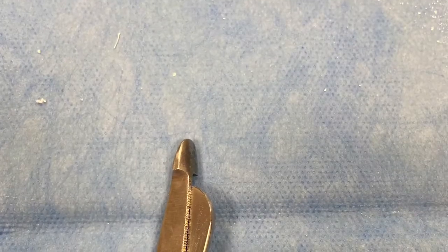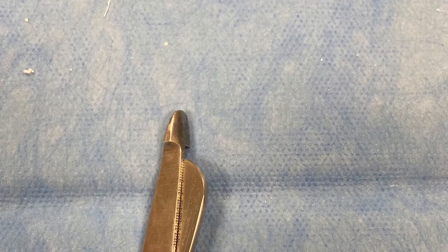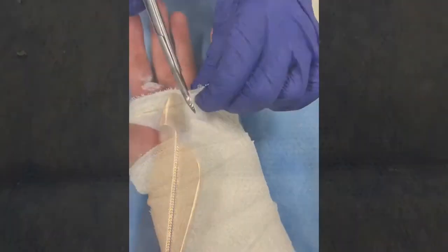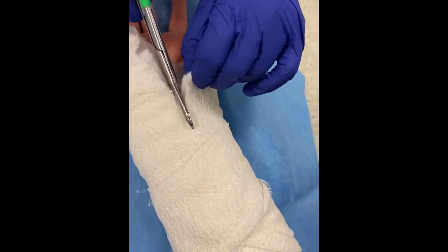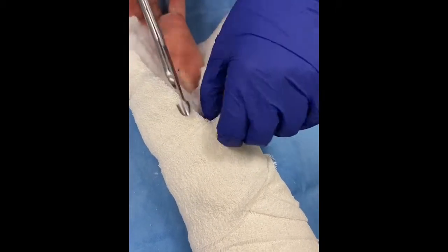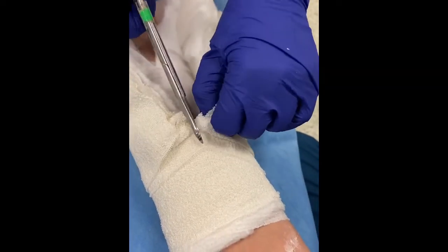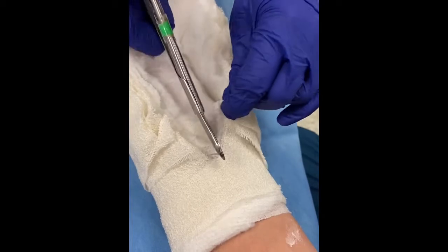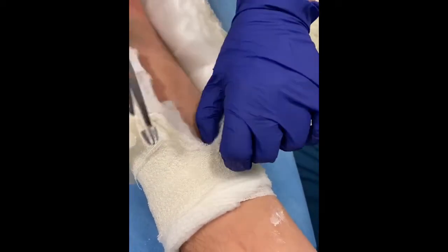Removal of the back slab is simple and requires only a pair of scissors. However, it is clearly possible to damage the skin when cutting blind and therefore special plaster scissors are used. These have the lower jaw with an extended blunt tip which can be put under the padding without any risk of cutting the skin. It is then a simple matter of working one's way up through the various layers of padding on the non-cast surface — in this case the volar surface — until the cast is completely free, at which point it can be removed easily.